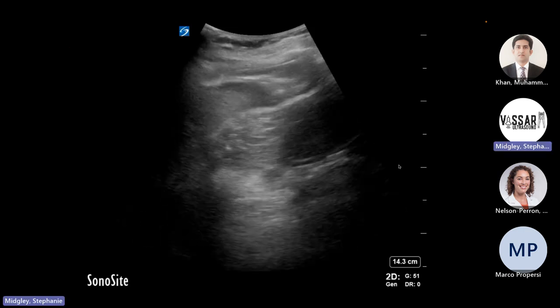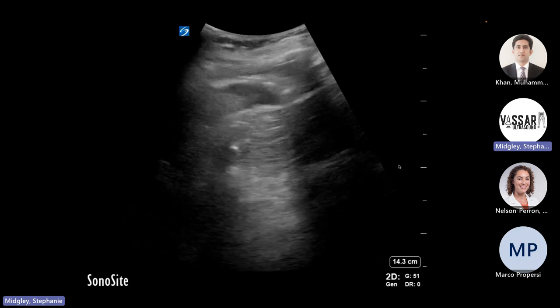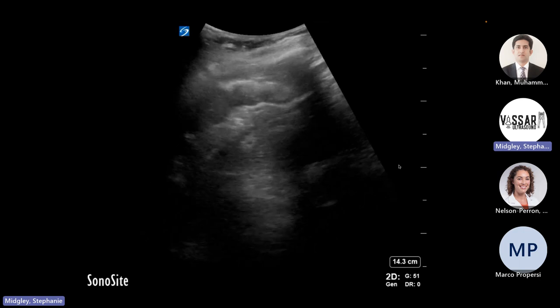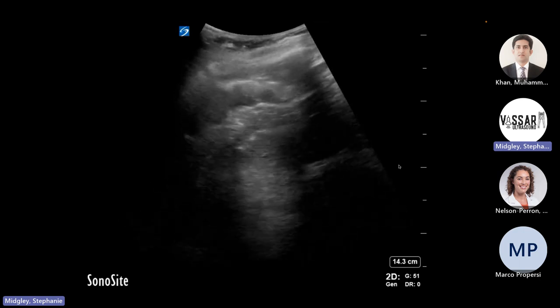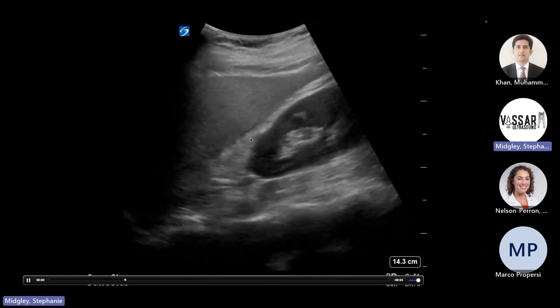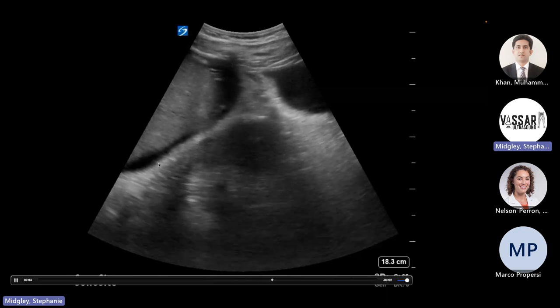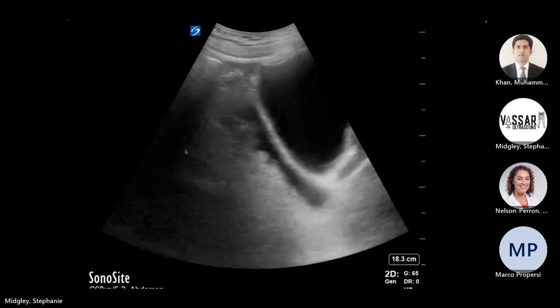So now you do your ultrasound, right? Because we're trying to figure out what's going on because now she's becoming unstable. And one of the things we worry about when you have peptic ulcer disease, if it's not a worsening GI bleed, maybe they perforated, right? So looking through, we can see there's a very subtle positive FAST. Then we come on this side, we can see there's a little bit more, yeah, right? This one not so subtle.